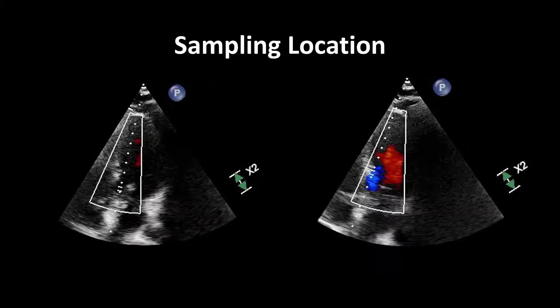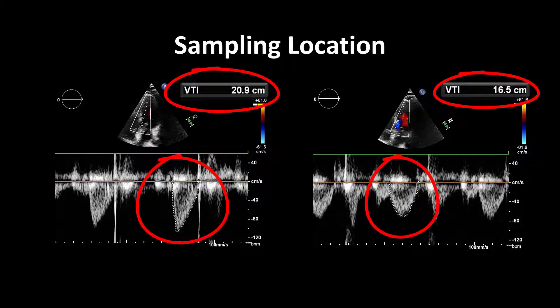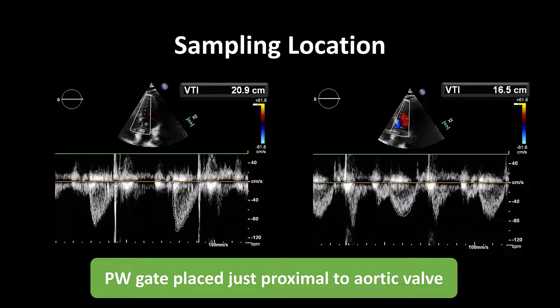Let's go over a few sampling location errors. In order to obtain a good LVOT VTI, we need to be in the LVOT. On the left, the pulse wave gate is placed in the LVOT just proximal to the aortic valve. On the right, the pulse wave gate is placed a little bit higher up in the LVOT. On the left we have that nice envelope, but on the right the envelope looks morphologically different — we don't see the aortic valve closure, so we know we're further up in the LVOT and the VTI is underestimated. Make sure the pulse wave gate is placed just proximal to the aortic valve itself; seeing the aortic valve closure can reassure you that you're in the right location.